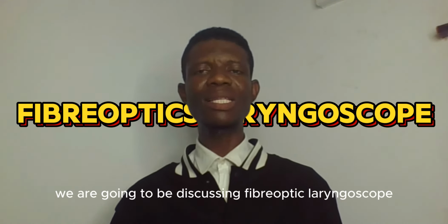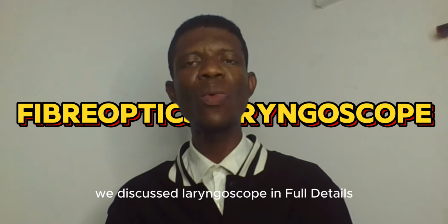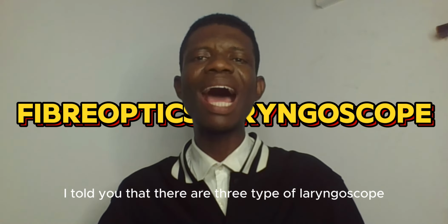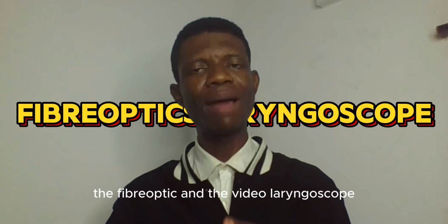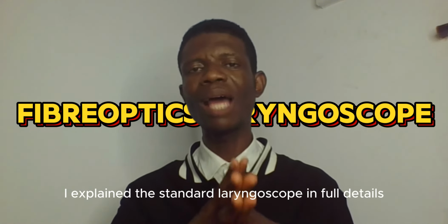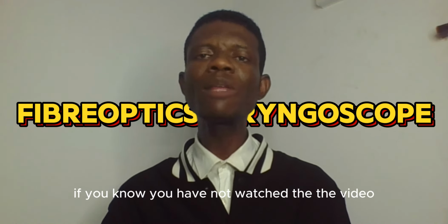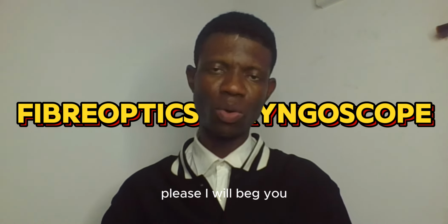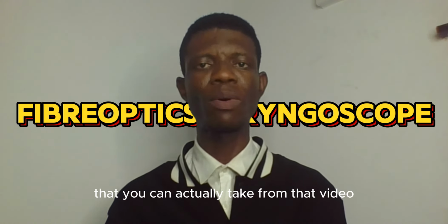Today we are going to be discussing fiber optic laryngoscope. Remember, during my last video, we discussed laryngoscope in full details, in which I told you that there are three types of laryngoscope. We have the standard laryngoscope, the fiber optic, and the video laryngoscope. And also remember that I explained the standard laryngoscope in full details. So please, if you have not watched the video, I beg you, go and watch it, because there are a lot of things that you can pick from that video.